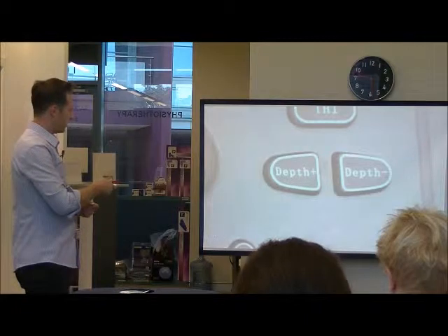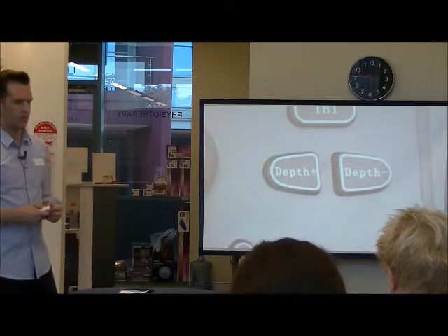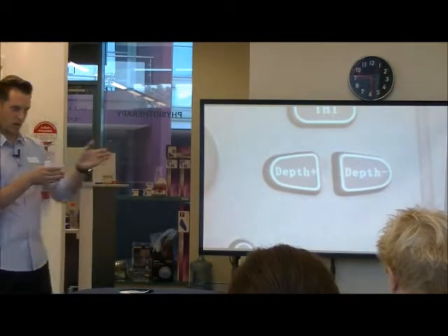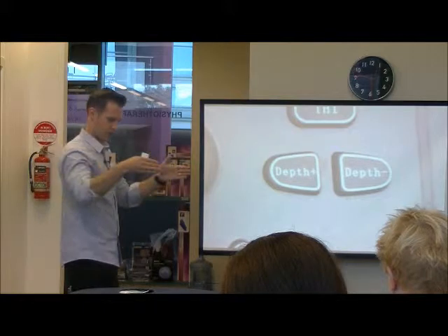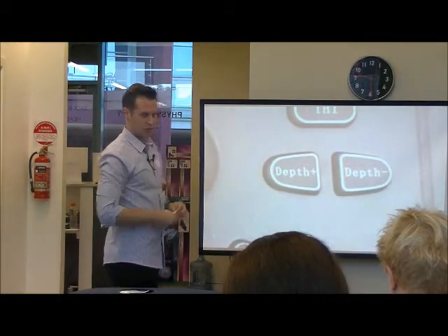The next button we'll have a look at is the depth. Now, these units that we're using today have an automatic focus, and that's important because the slice thickness of the ultrasound, even though we get a perfect two-dimensional image, it's actually three-dimensional. So if we've got an ultrasound head and the sound waves are converging like that, they're going to have a focus point, but our units use automatic focus.